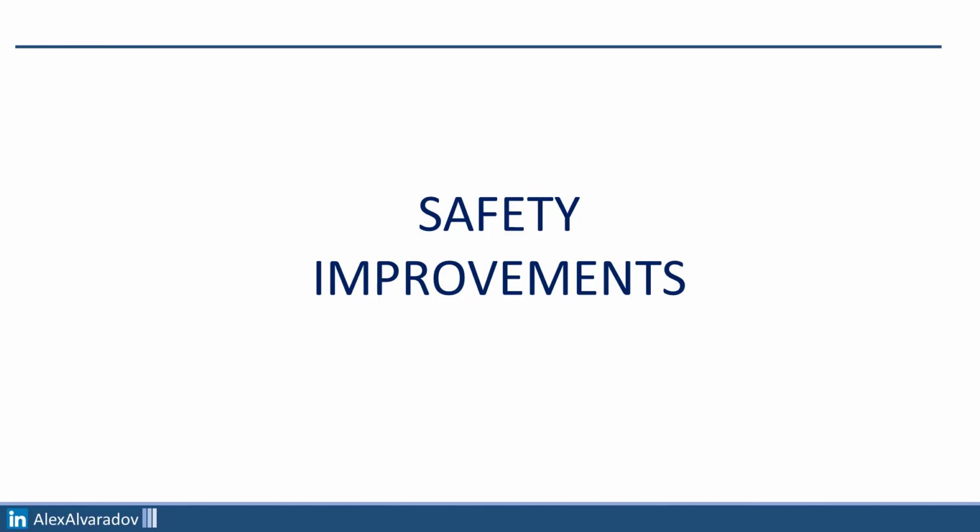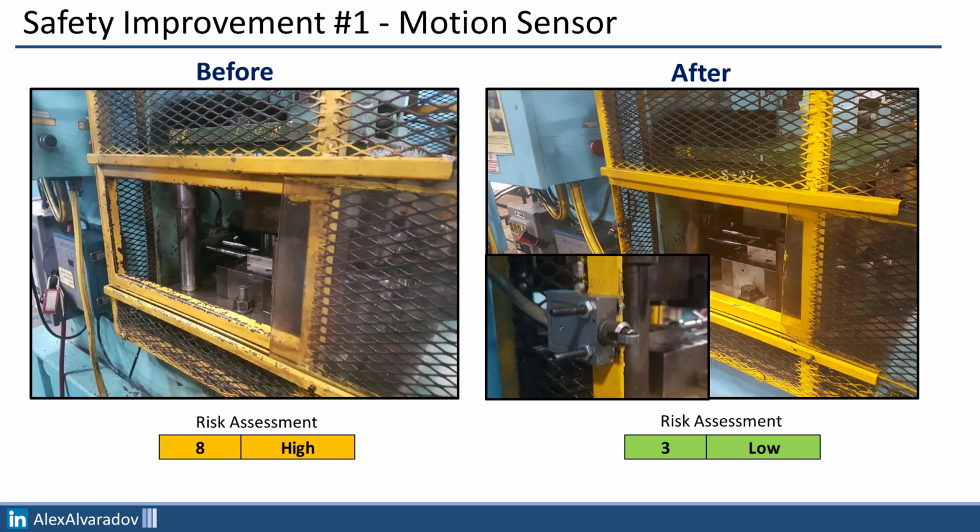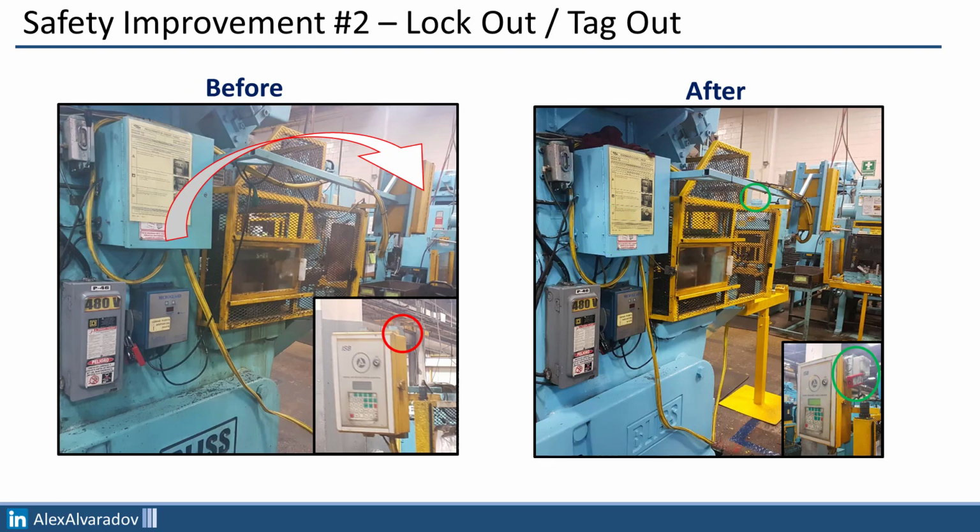As part of any Kaizen event, you have to include safety improvements. On before situation, they didn't have a sensor to stop the machine in case of opening the window. Worst case scenario, someone opens the window to start the changeover and the press could be still working. The team installed a sensor that if the window is open, the machine automatically turns off. Also, the lockout tagout button was relocated from the side part of the press to the front part. This also eliminates walking around the machine during the changeover.